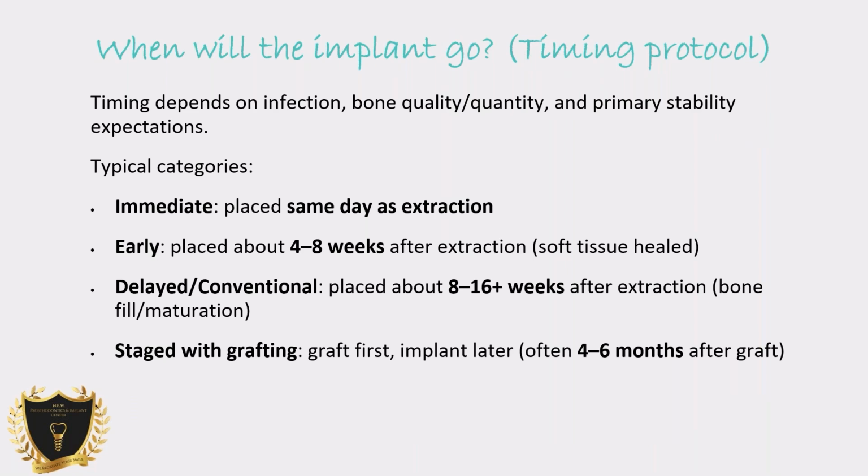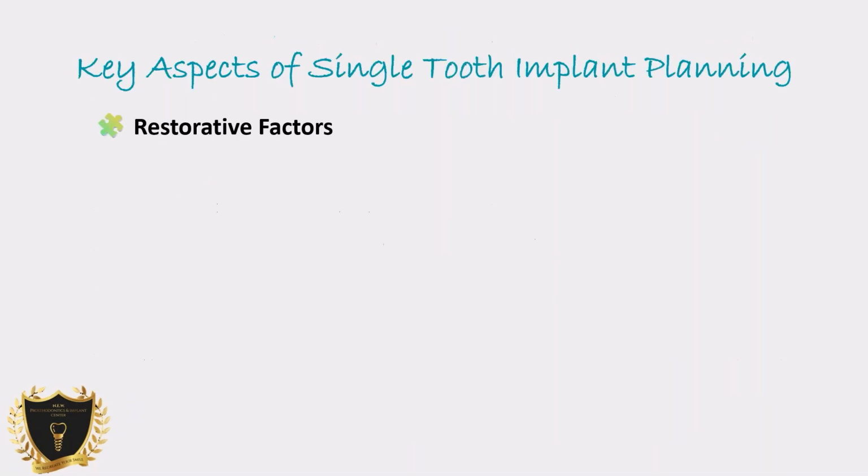You can stage the implant to do grafting, come back and heal depending on the grafting material. You may have to wait 4 to 6 months. That will decide what type of material you're using.